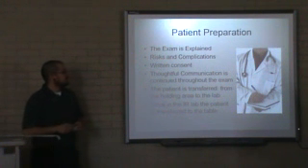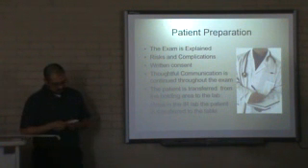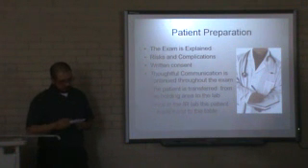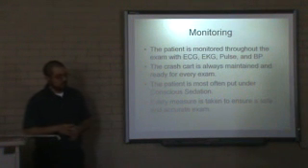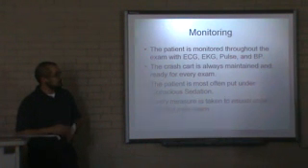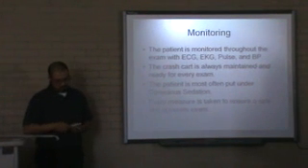From there, the patient is taken into the lab, and once in the lab, is transferred to the table. The patient is monitored throughout the exam for the ECG, the pulse, and the blood pressure. And the crash cart is always available at all times.